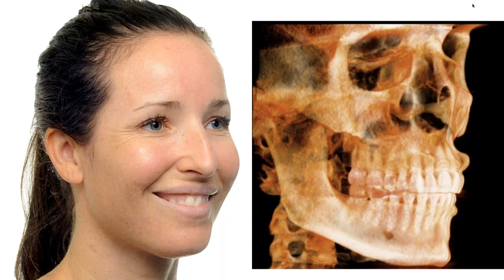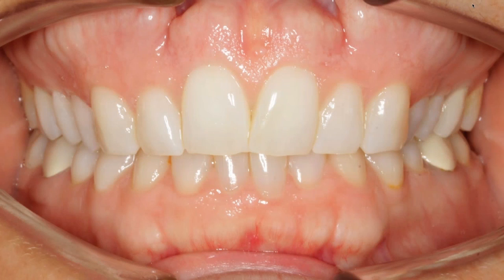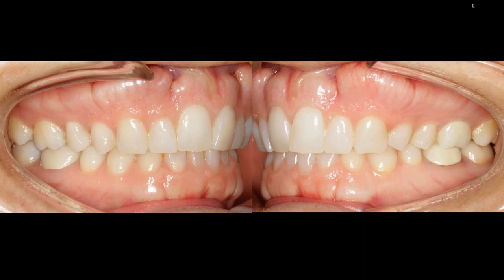This type of case is very difficult. If you look here, many people would be intimidated by these huge buccal shelves, buccal exostosis, and all of her teeth are dumped in, and I call them collapsed, and she wants treatment, but she wants it done fast. And you know, this type of case is a very difficult case to get arch width and to be done in a quick, timely manner. So I talked to her about osteoperforations and told her that we can correct and get the arch width.